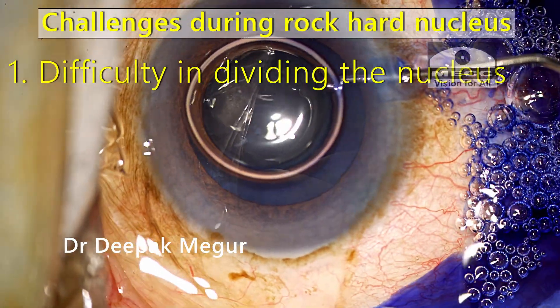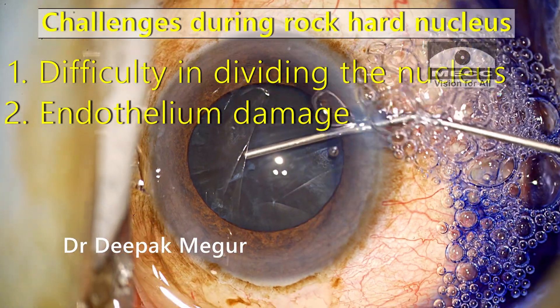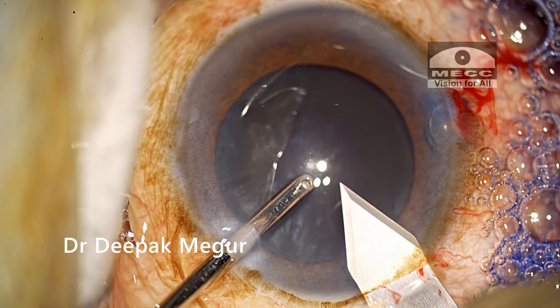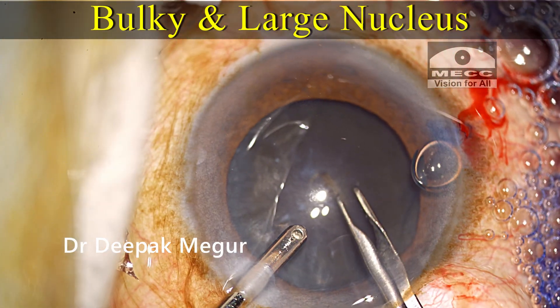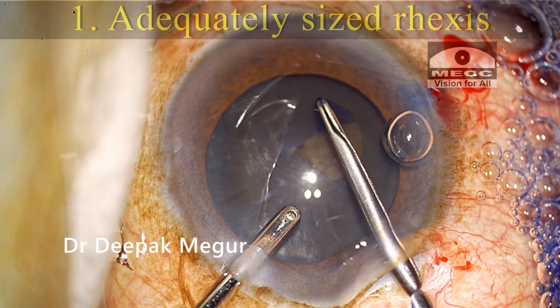The challenges include difficulty in dividing the nucleus, potential damage to the endothelium, higher chances of capsulo-zonular complications, possibility of wound burns, and the fact that apart from being very hard and dense, it is also a bulky nucleus occupying almost the entire bag.